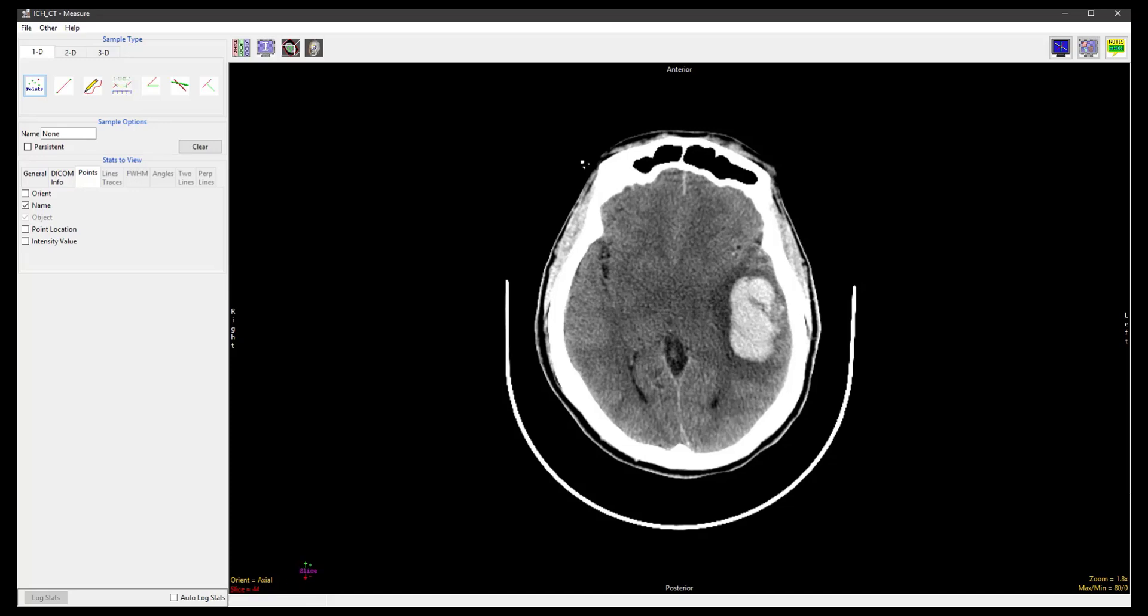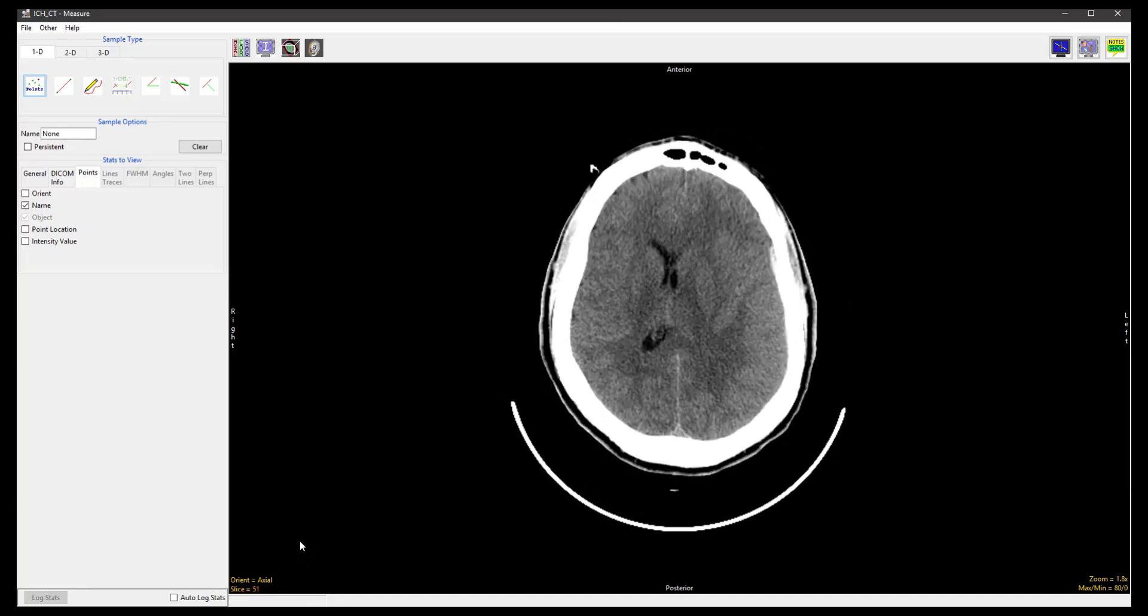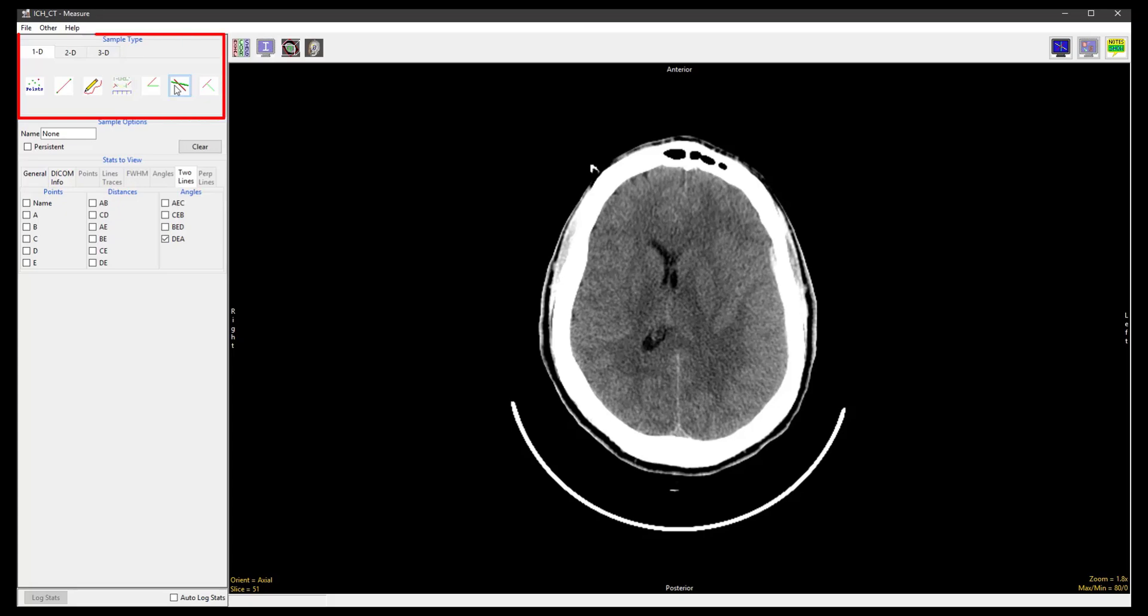Using the Slice tool, navigate to a slice in the upper brain. Select the 1D sample type and choose Sample Two Lines.